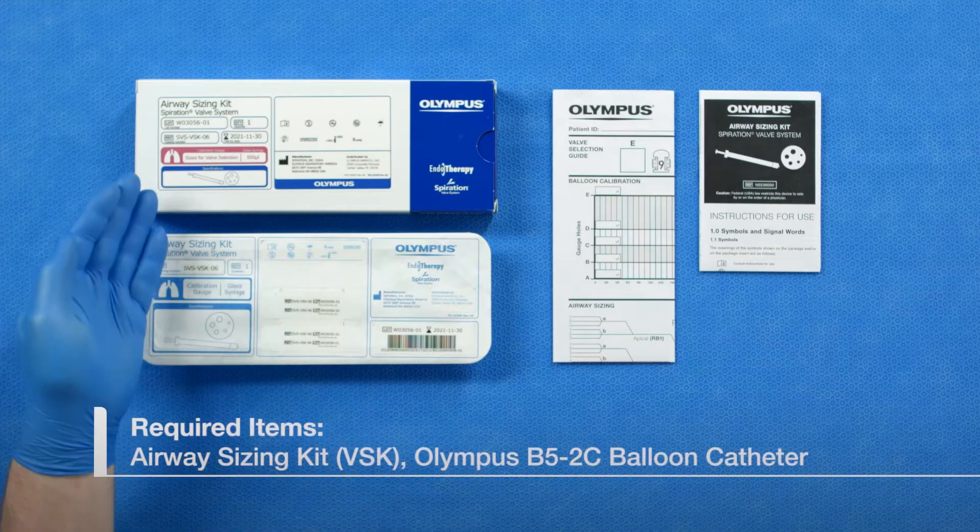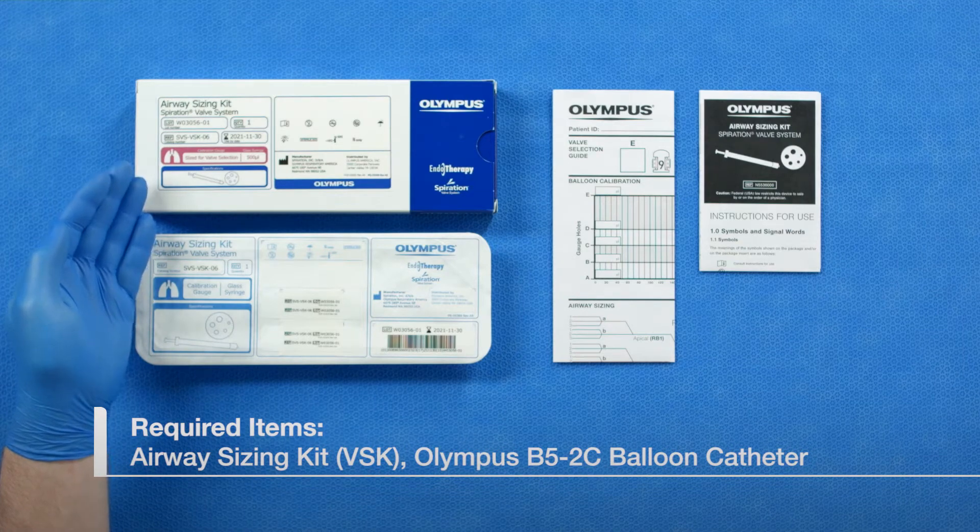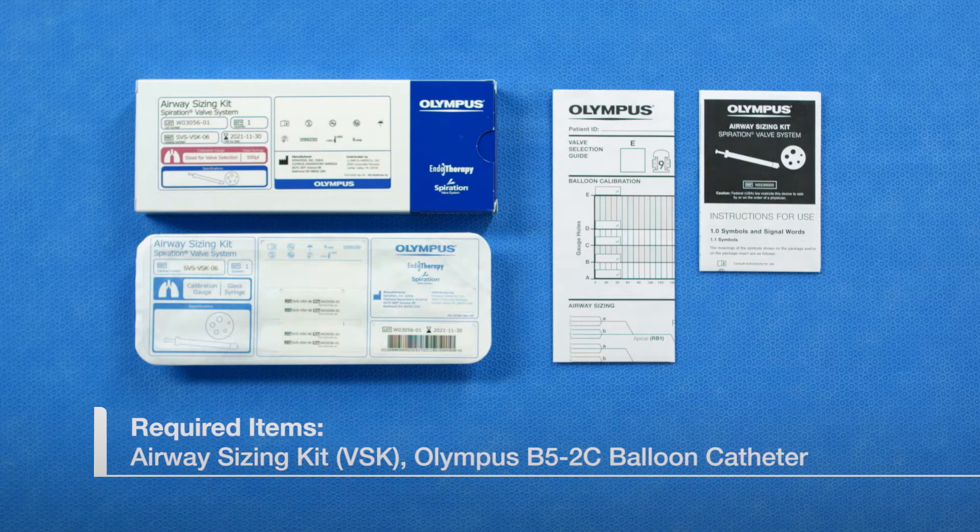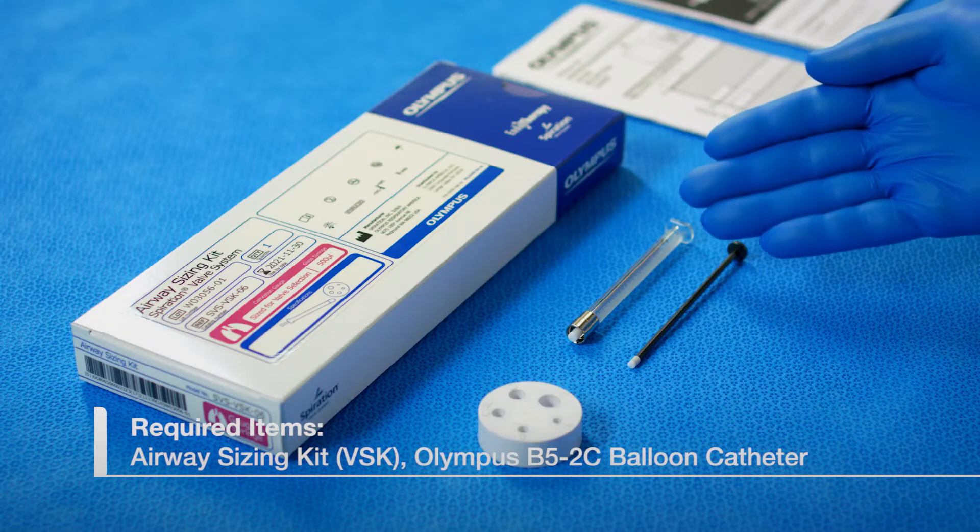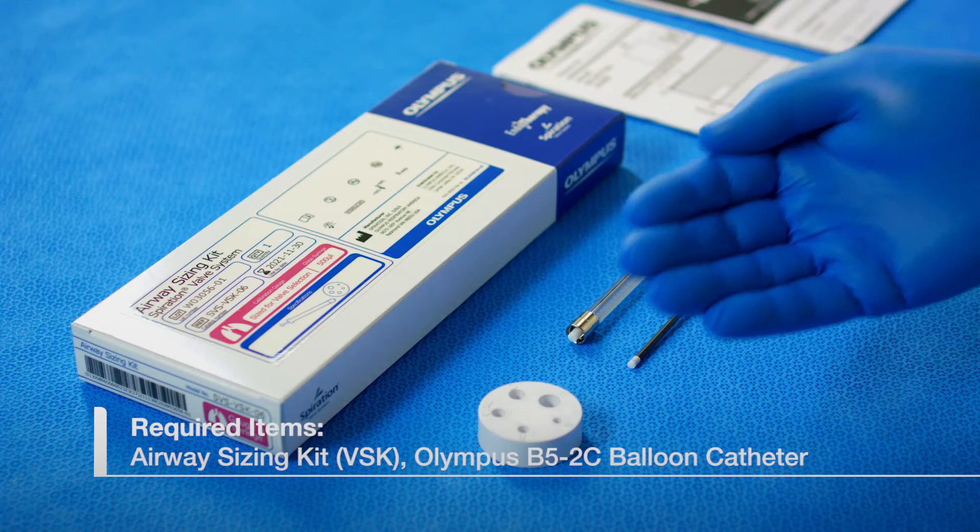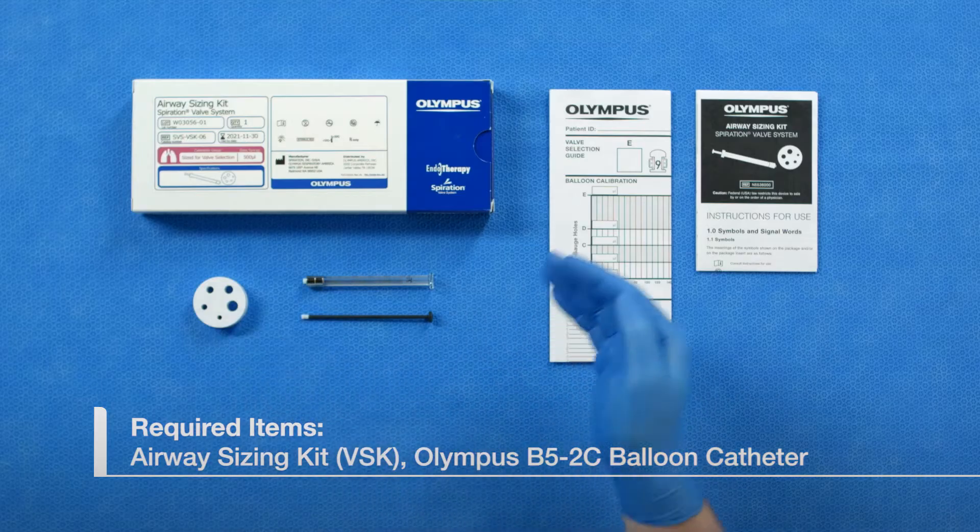The airway sizing kit in conjunction with the Olympus B5-2C balloon catheter is used to determine the appropriate valve size to use for each target airway. The airway sizing kit consists of a glass microliter syringe, a calibration gauge, and a sizing worksheet.